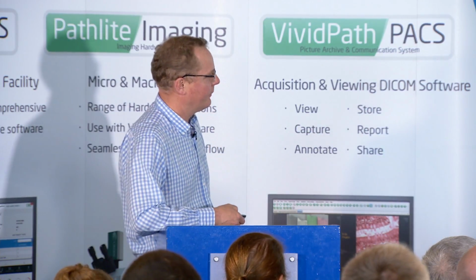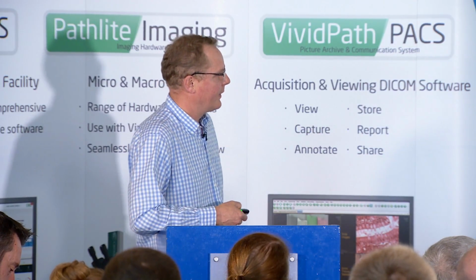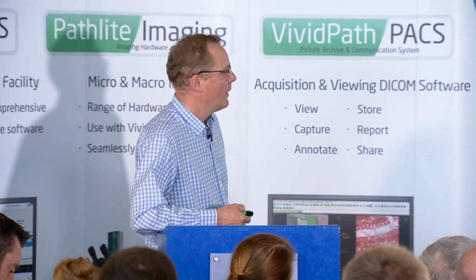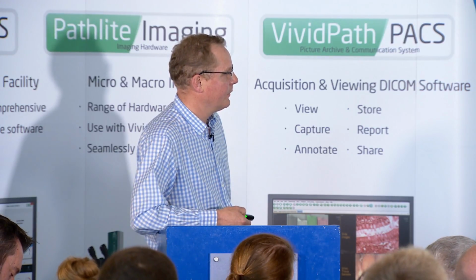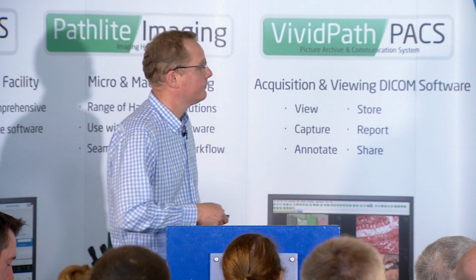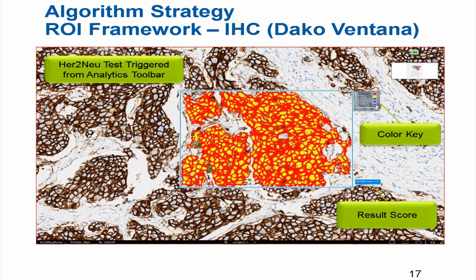Now, this is obviously a piece of breast cancer which has been stained. The pathologist has then looked at it and he's selected this area to score. And all the algorithm does then is produce the result for that area. So that's a tool that's used at the workstation by the pathologist, looking at the stain, selecting the area and running the algorithm. And that's available. It's in the market now, and it's being used by many groups.